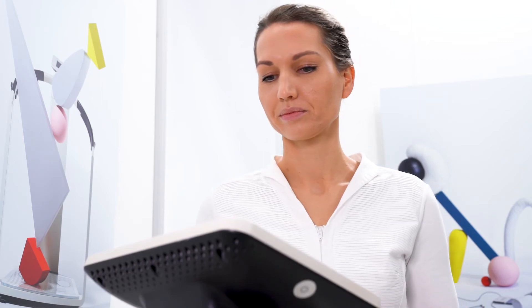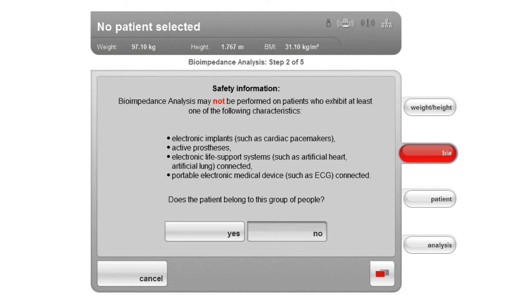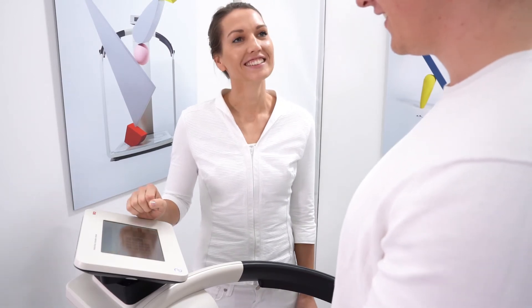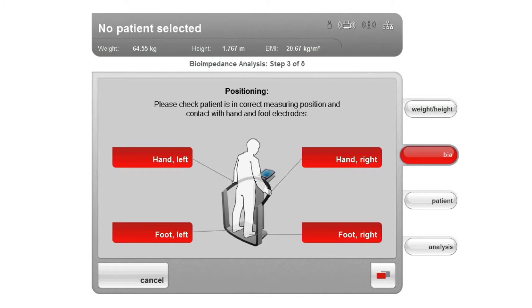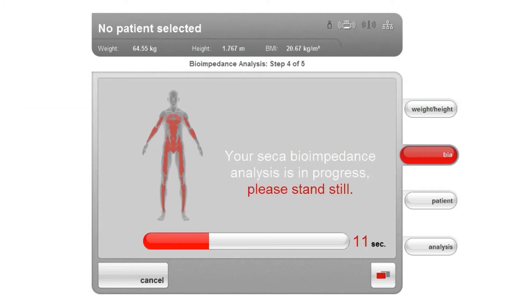To perform the bioimpedance measurement, activate the BIA tab. Specify whether the individual belongs to a group of persons for whom bioimpedance measurement must not be performed. Only if the test subject does not have any of the listed contraindications may the measurement be continued. Before each measurement, the device checks the contact of the hands and feet to the electrodes in a short test. If the test subject has proper contact with an electrode, the corresponding electrode indicator on the display is shown in green; otherwise it is shown in red. Only when all electrode indicators on the touchscreen display are green does a countdown appear to indicate the time until the start of the measurement.